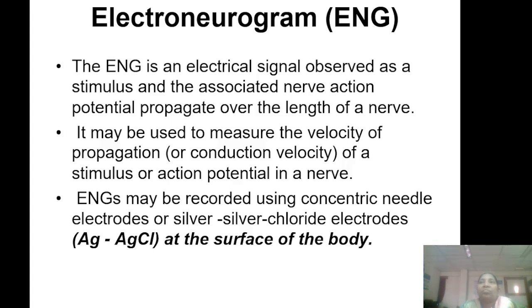We calculate the nerve conduction velocity from the time taken between applying the stimulus and getting the response of the nerve, together with the distance between the ring electrode and the electrode placed above the elbow, because the nerve conduction takes place through that path. When you apply the current to the ring electrode on the finger, we can feel the shock at that region above the elbow. So through this the nerve conduction takes place.